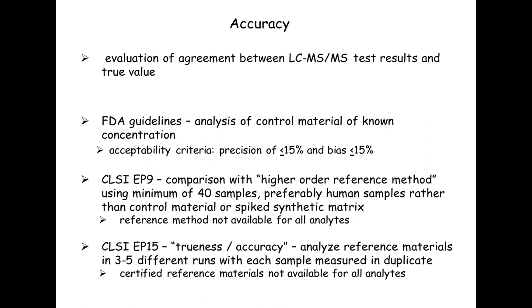Okay, so now we're going to drill down and look at each parameter individually. So first of all, we're going to talk about accuracy. So accuracy is the evaluation of agreement between LC-MS test results and the true value.